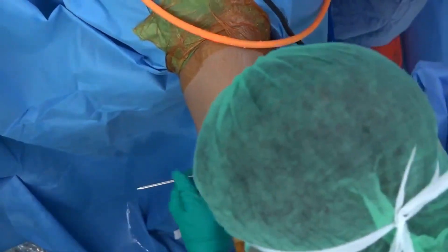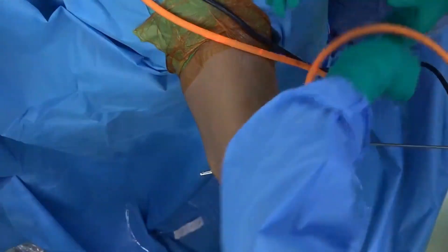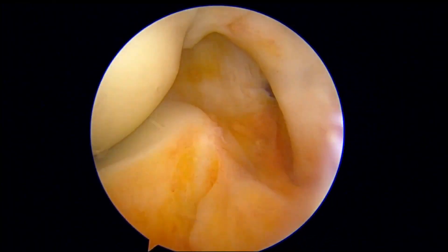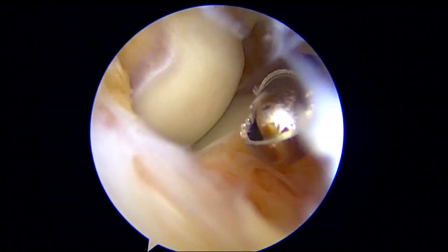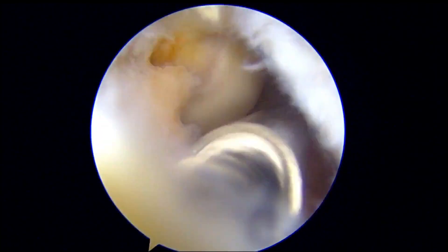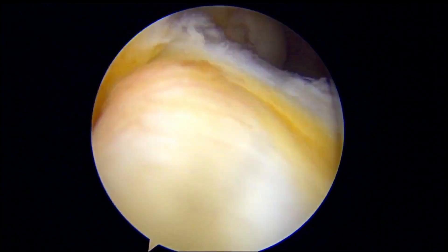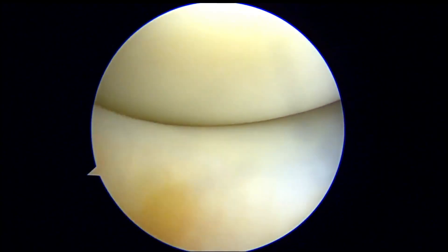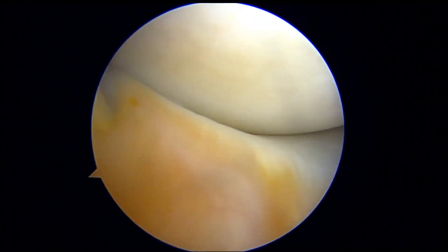This method is very safe. Next, the septum is cleaned using a shaver and RF with an up and down motion in the same plane, without directing posteriorly. In this view, we can also identify the popliteus tendon.